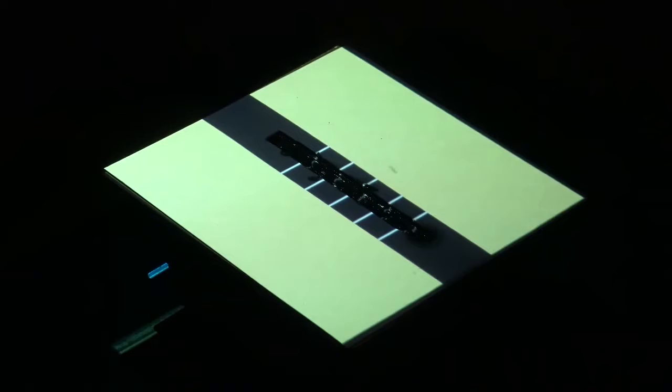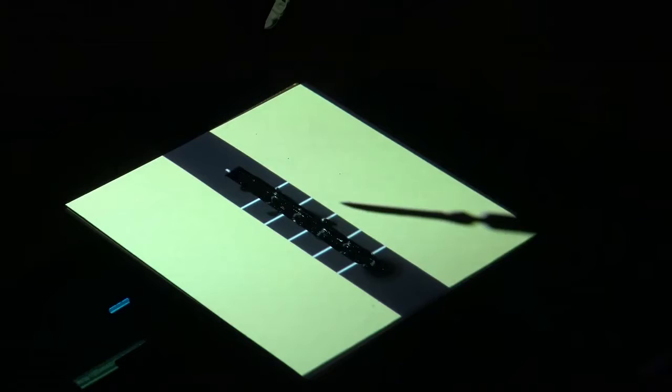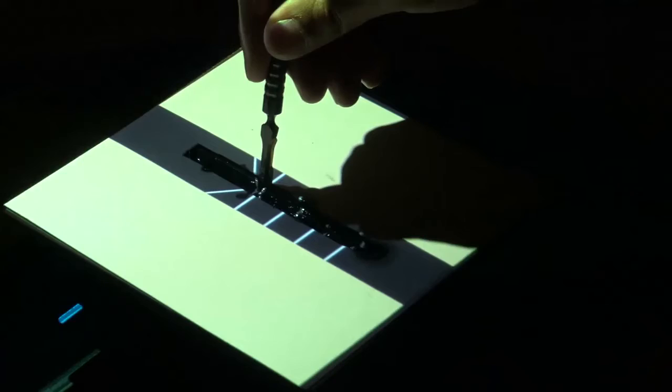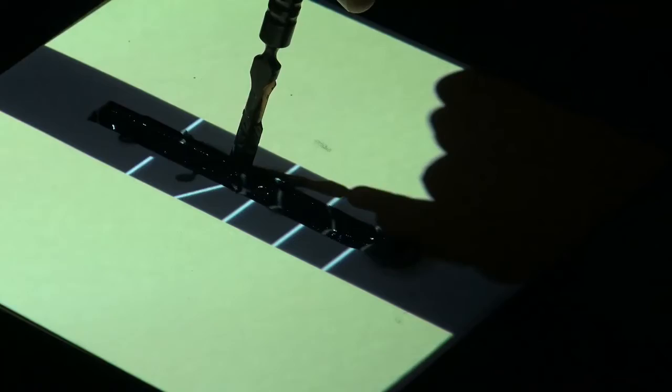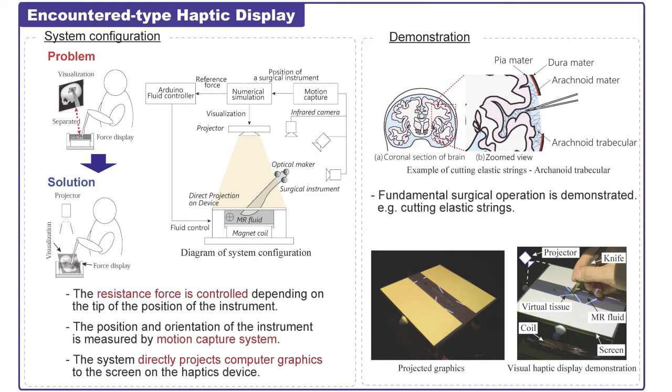Because of the direct projection, the point of view and the operational point are perfectly consistent. The target simulation is to cut elastic strings. When you touch the instruments, you can feel the changing force. If you want to try this device, please come to our booth. Thank you.